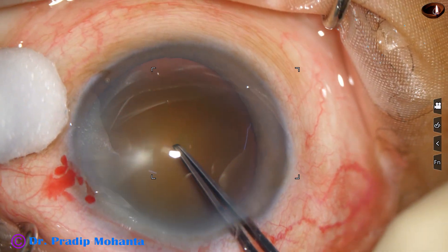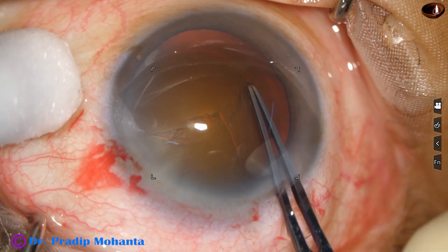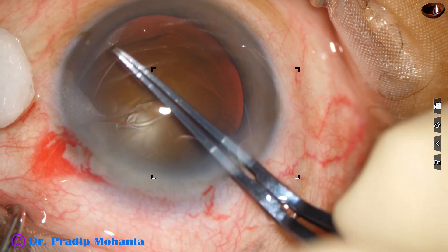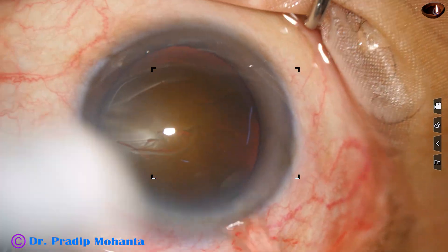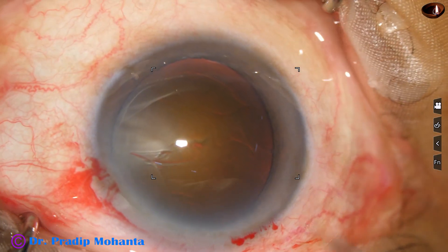The anterior chamber has been filled up with 2% hydroxypropyl methylcellulose. Methylcellulose has been applied over the corneal epithelium and now capsulorrhexis is being done with the utrata forceps. This is a large rhexis — the size is about 6 mm, maybe 5.75 mm.